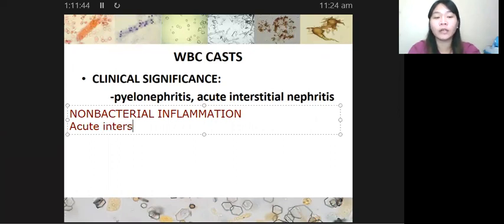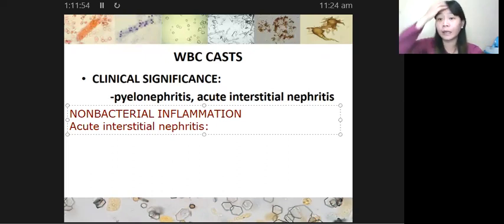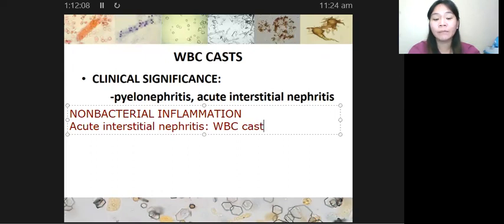So first, we have your acute interstitial nephritis. Okay? So hindi na bago class ang acute interstitial nephritis sa atin. Nabanggit ko na yan several times doon sa mga previous videos natin. Okay? So ano ang hahanapin natin together with your WBC casts? Syempre meron tayong WBC casts, okay?